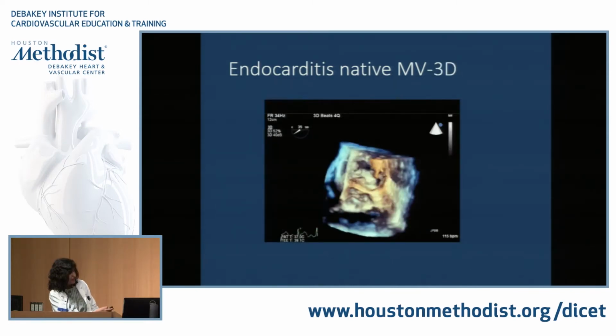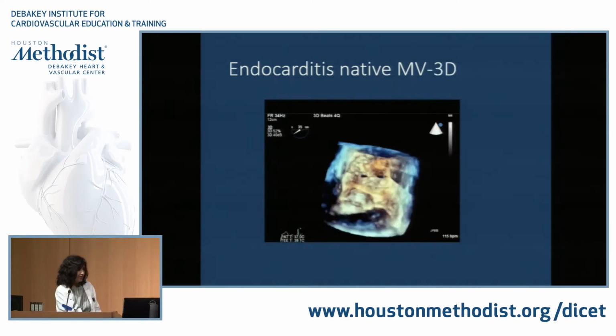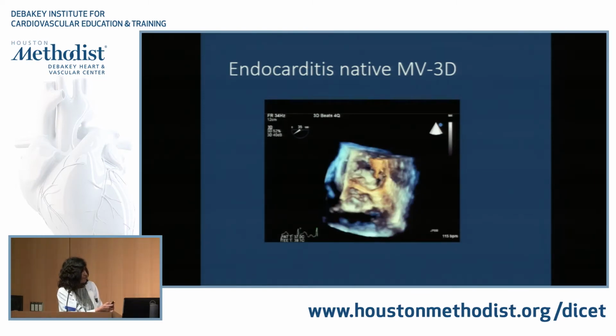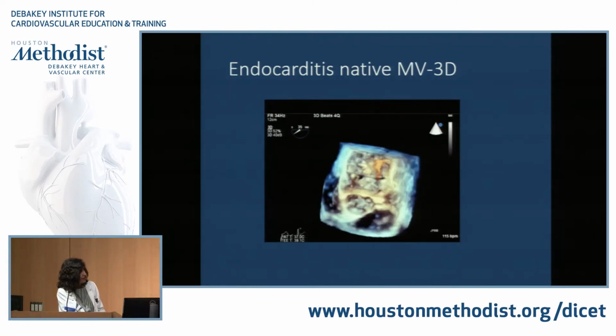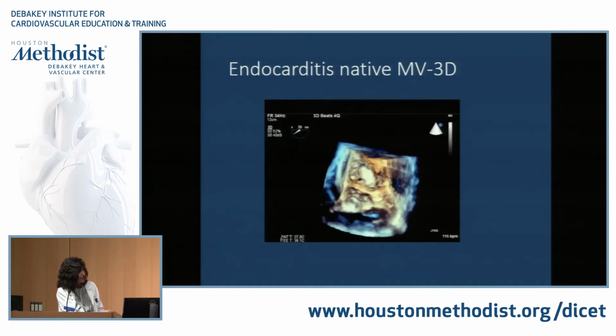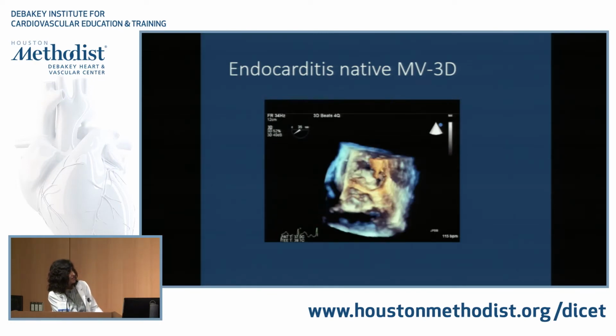And this is a beautiful 3D image. And I'm going to show you the hole here in the anterior mitral leaflet. This is the hole here. And this is the posterior leaflet that's prolapsing back. So again, beautiful images and data available on TEE.